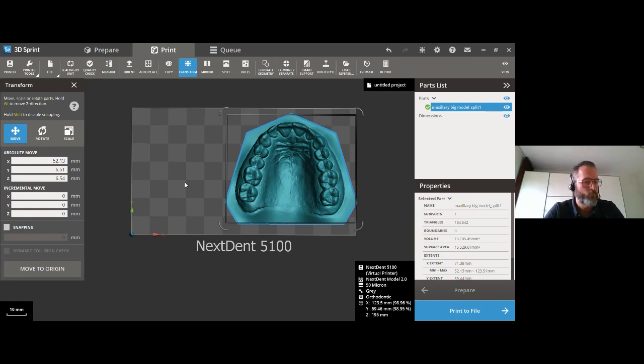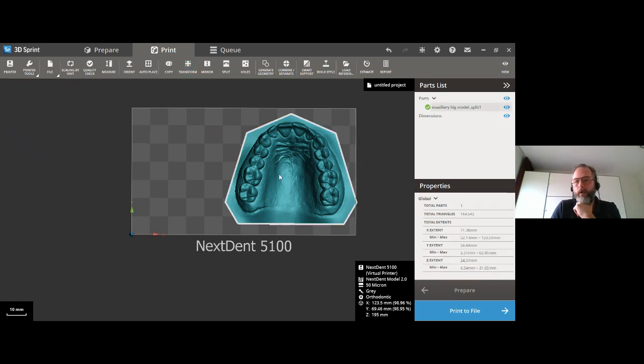That is great. Perfect. Still one more question, or I think it will be the last question. We take it back to dentures now. You showed the orientation of the denture base. Is that the recommended denture base orientation, and why is it? Yeah, again, a good question.